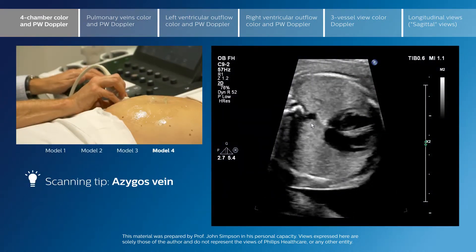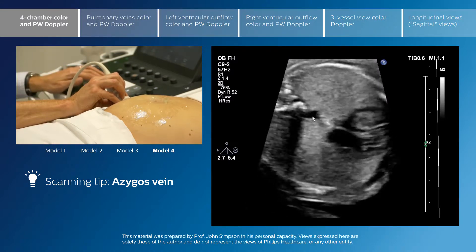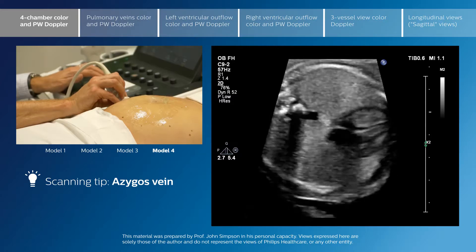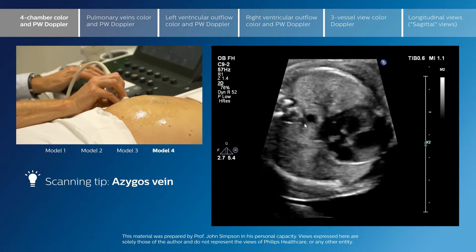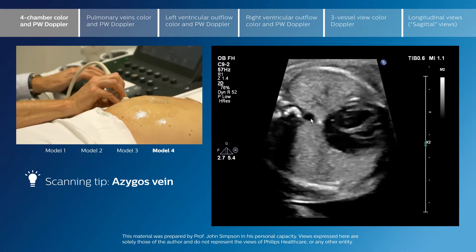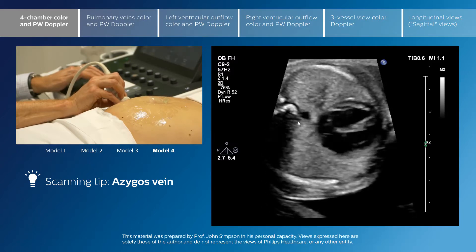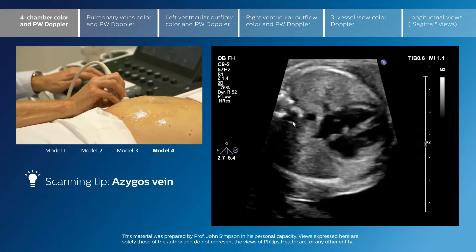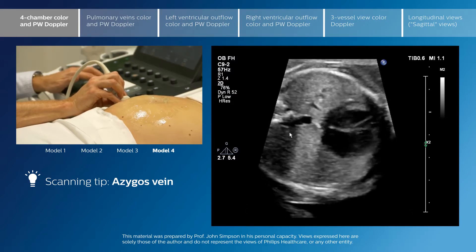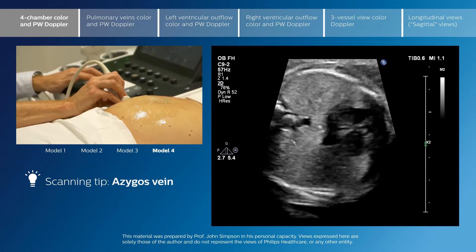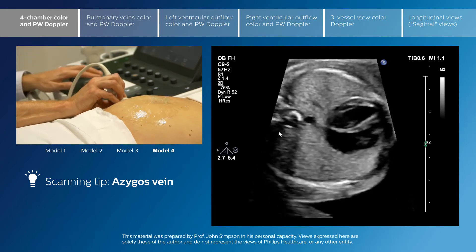With higher resolution equipment, you can see beside the descending aorta a very small vessel sitting alongside it. This is in fact the normal azygous vein and should not give concern — it is a normal finding in the fetal heart, visible more clearly because of the high resolution. Of note, a vein lying in this position should be tiny by comparison with the size of the descending aorta. If you see a vessel in this position which is as big as, or almost as big as, the descending aorta, it would make you suspicious that the inferior vena cava may be interrupted and that flow above the diaphragm may be via the azygous vein.